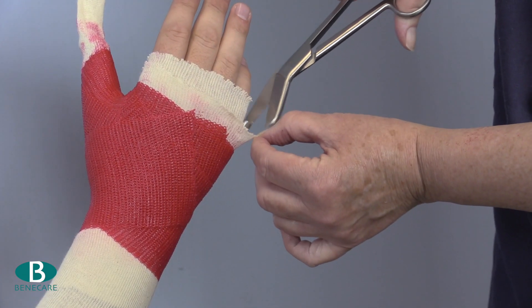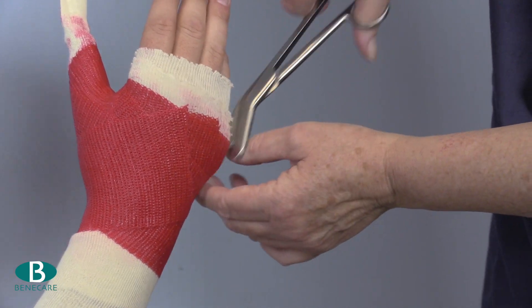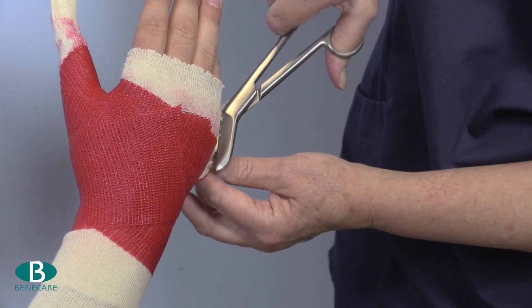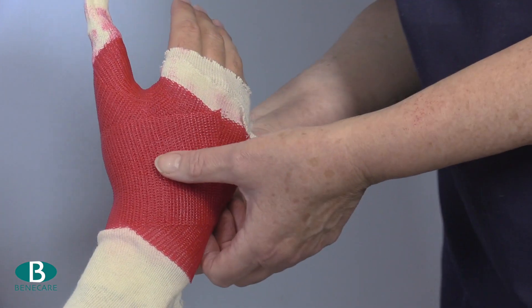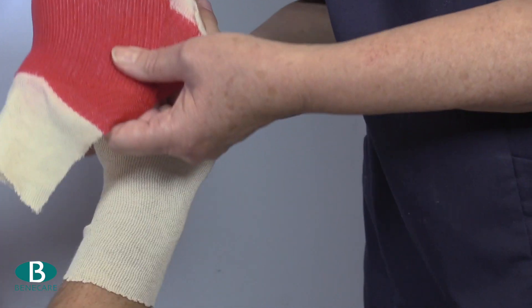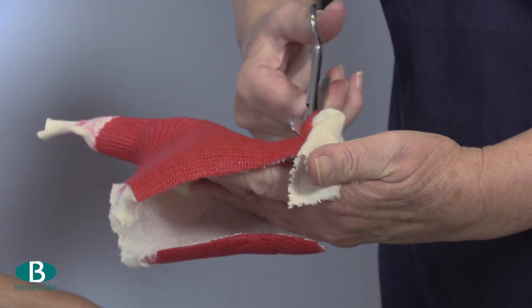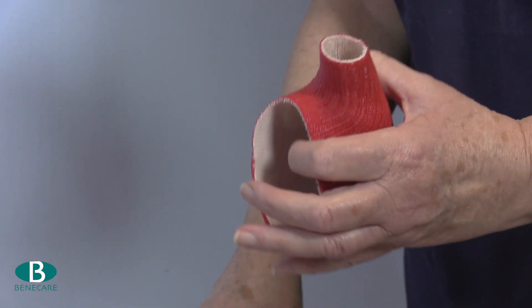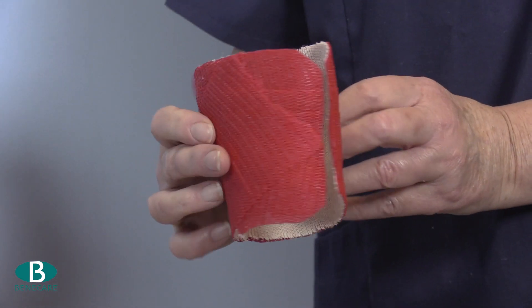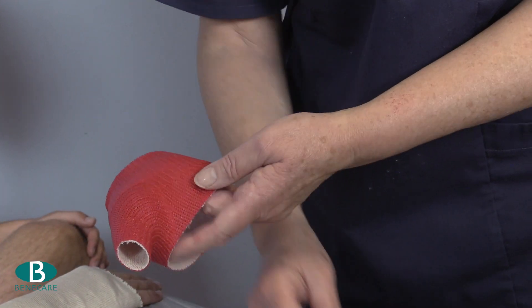Cut the cast along the medial border using bandage scissors and remove from the limb. Trim the cast to the extent required. I have chosen not to edge the cast today; however, elasticated strapping or fleecy edging can be used if required.